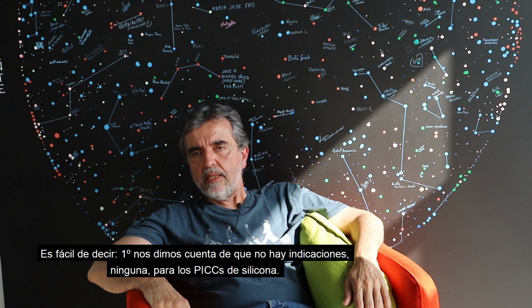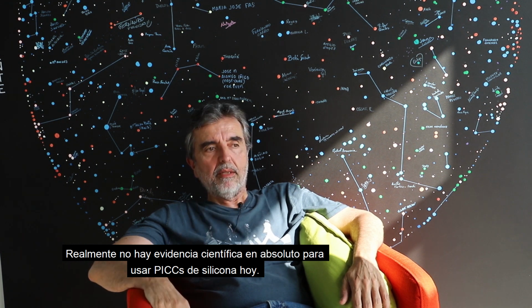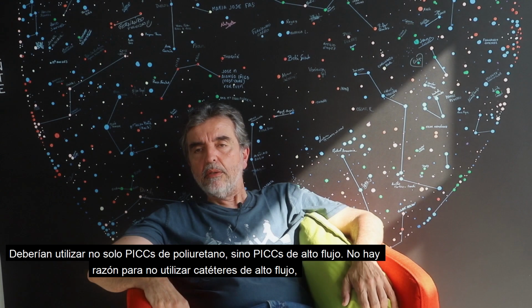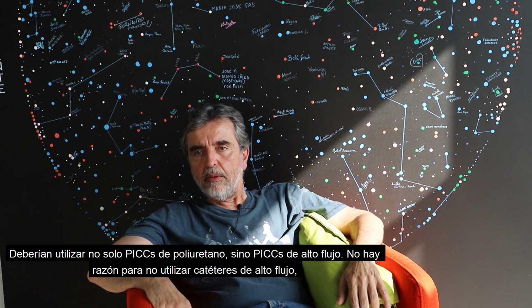Well, it's easy to be said. First, we have realized that there is no indication whatsoever for silicone PICCs. There is really no evidence. I mean, to use silicone PICCs today is absurd. You should use not only polyurethane PICCs, but power injectable polyurethane. There is no reason for not using power injectable polyurethanes.